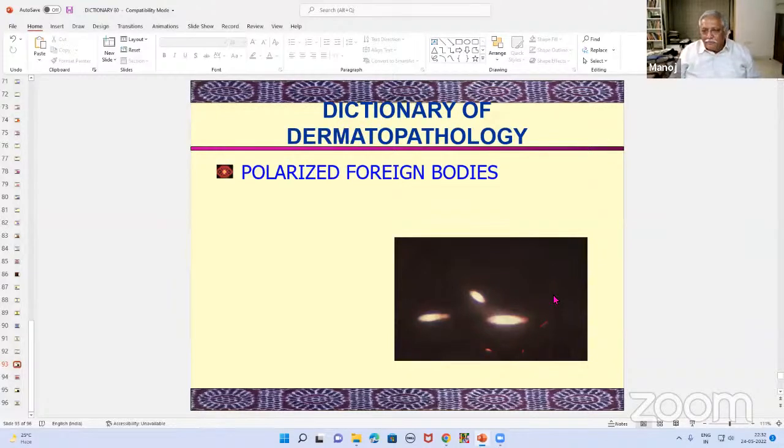Again, a cyst which was taken out, and it's got a normal epidermis. Now, I don't know which side was which, because we got just a section, but it's got the normal epidermal keratinization, keratin, and there is a huge thick band outside. I don't know what that band is. I don't know whether this is an epidermal cyst or a pilar cyst or one of them, because we don't know which is the inside and which is the outside. So maybe I'll show you pictures next time I come.